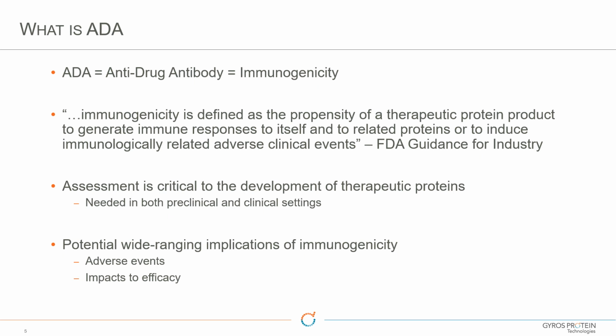Yeah, and I think one of the problems with preclinicals, because you're normally using much higher concentrations of drug and dosage, is that drug tolerance is a much bigger issue. I have particular examples where I'm trying to measure 100 or low nanogram per mil sensitivity of antibody with mg per mil of protein interfering. So you do need to add pre-treatment methods such as acid dissociation. As we're going to go through today, it is possible to fully automate acid dissociation as part of the Gyrolab workflow.